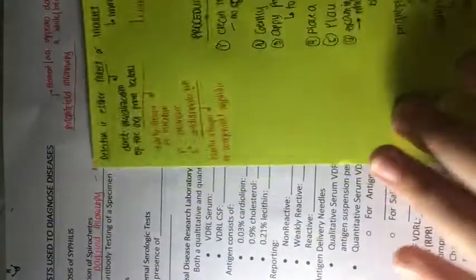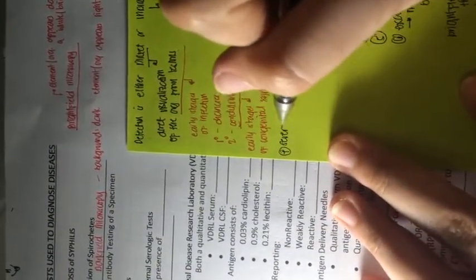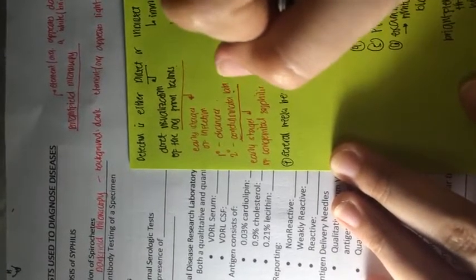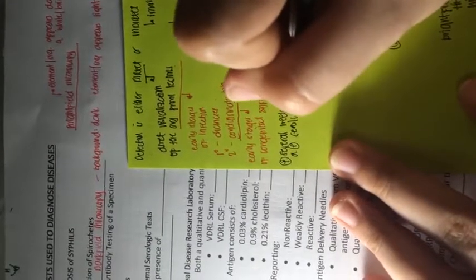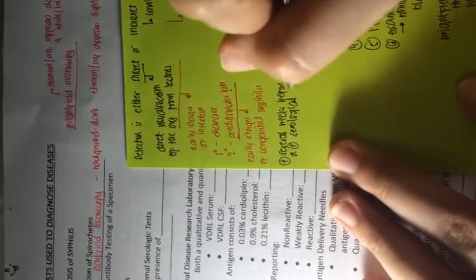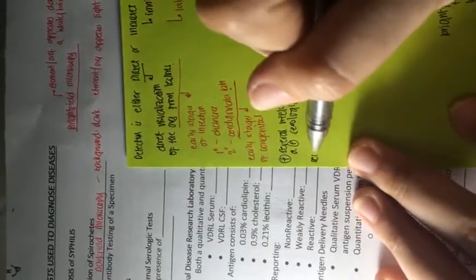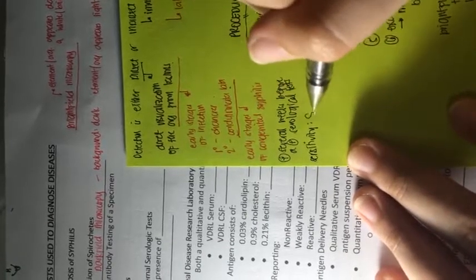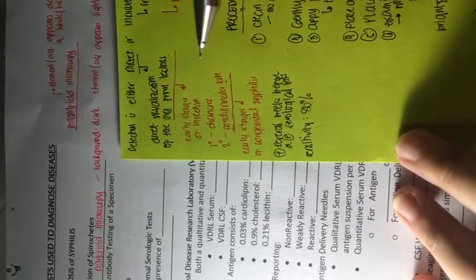Okay, so direct microscopy is actually positive several weeks before a positive serological test. And the sensitivity of dark field microscopy is around 80%. So it has a very good sensitivity.